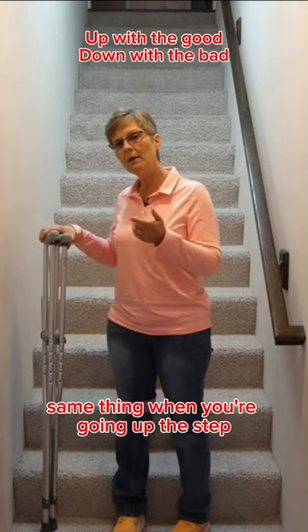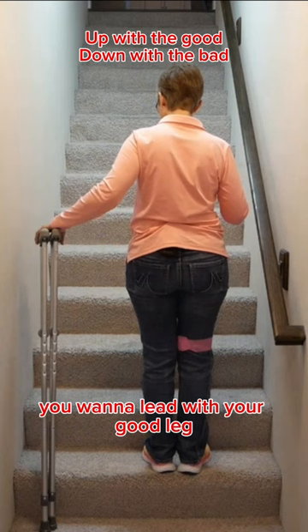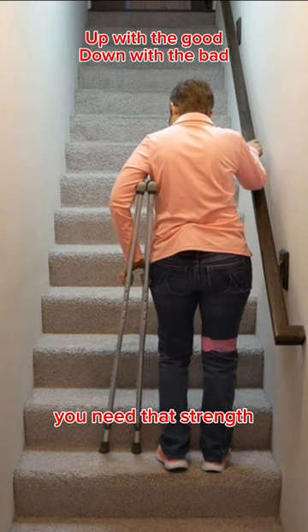Same thing when you're going up the step — you want to lead with your good leg, because when you step up you need that good leg to push up and bring the bad leg up. You don't want to put that bad leg up on the step and expect it to pull your good leg up.